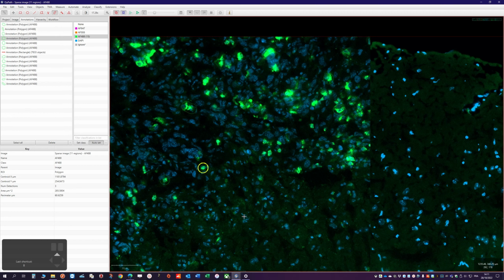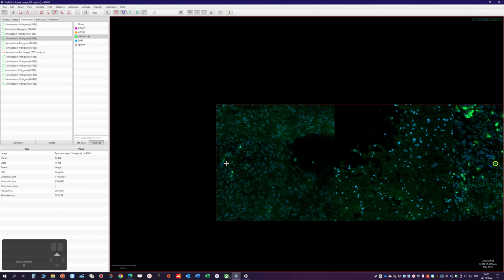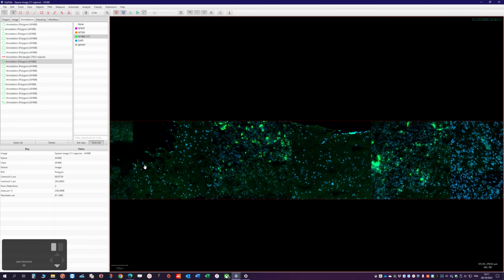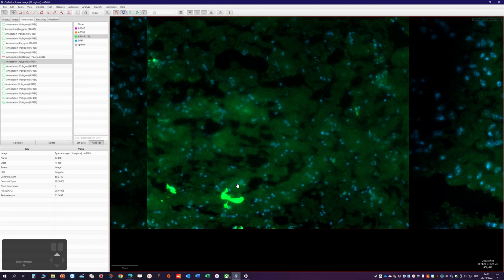This, like that. So we have a bunch of annotations here. Let's see. Maybe we can take another one into account here, like this, this, and this. So we have a variety of different cases here. Maybe here also.